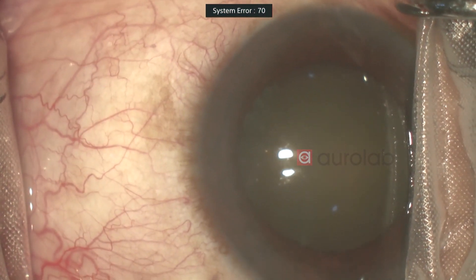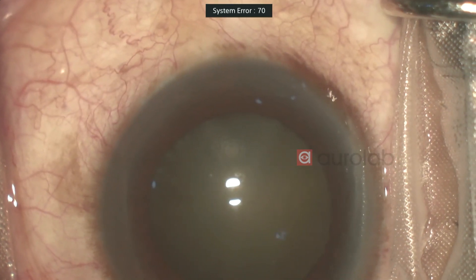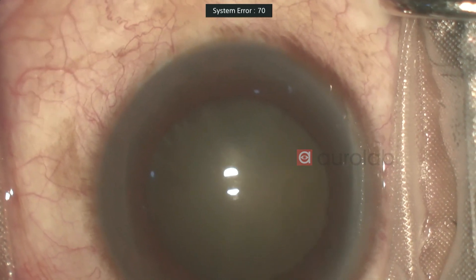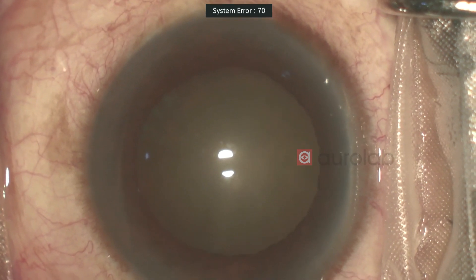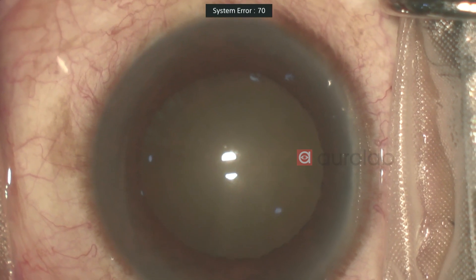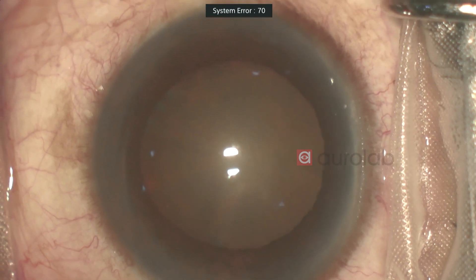This is a grade 2 cataract that I'm operating on. I'll be using the Oralabs Hummingbird machine. It's an entry-level machine and I'll demonstrate how well it performs. Today I'll show you a grade 2, but at any level or grade of cataract it's a very good machine that a surgeon can use.